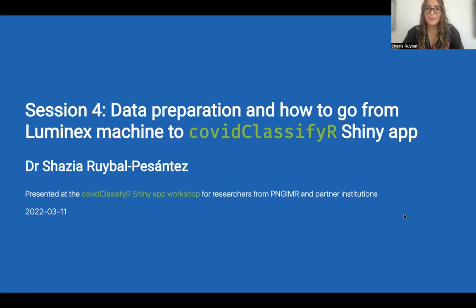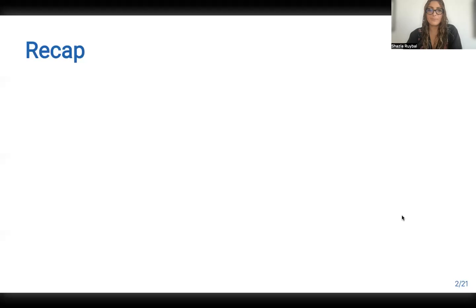All right. Well, good morning again, everyone, and welcome to day 2, session 4 of the covidClassifyR Shiny App workshop. Today, we're going to go over the data preparation and how to go from exporting your data from the Luminex machine to importing it into the Shiny app.